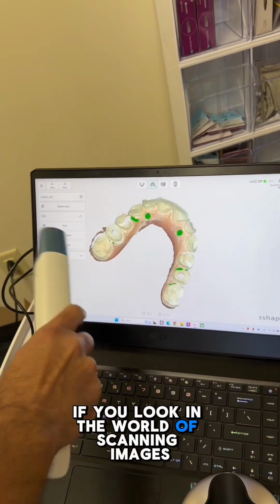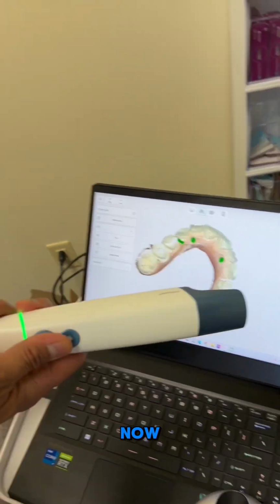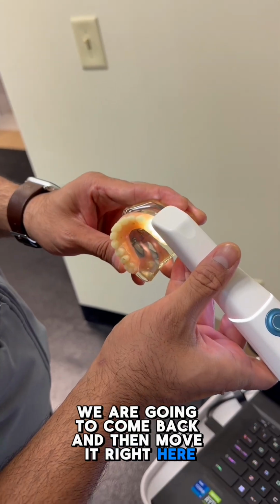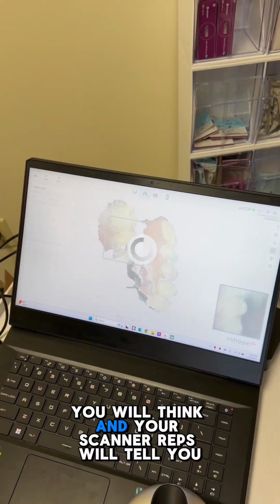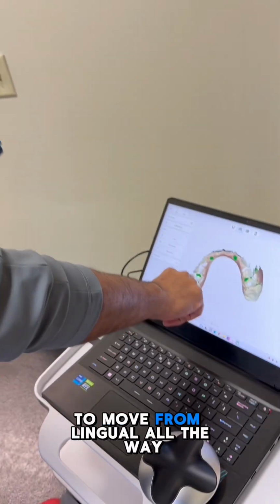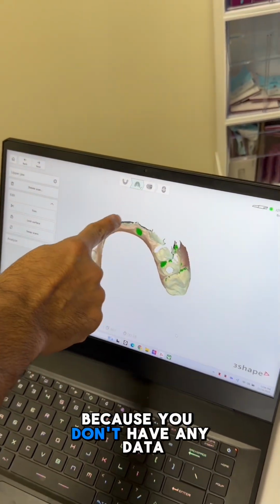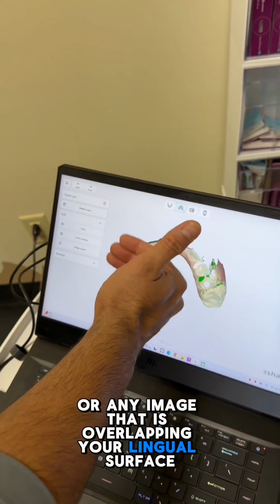If you look in the world of scanning, images stitching together, you took all the palatal scans. Now we are going to come back and then move it right here. What's wrong in this picture? You will think, and your scanner reps will tell you, there's nothing wrong with this, but I'll tell you it's absolutely incorrect to move from lingual all the way and then come buccal, because you don't have any data or any image that is overlapping your lingual surface.